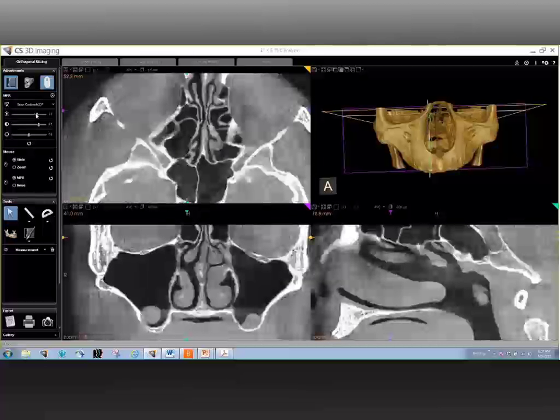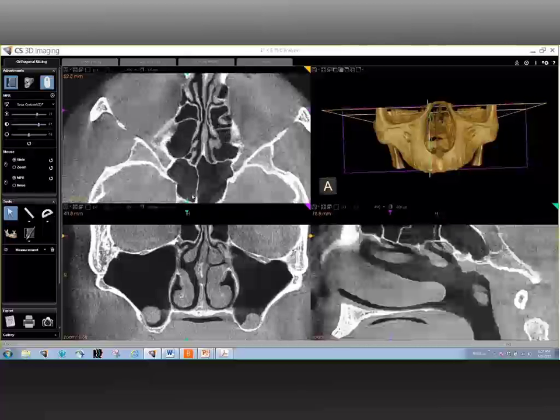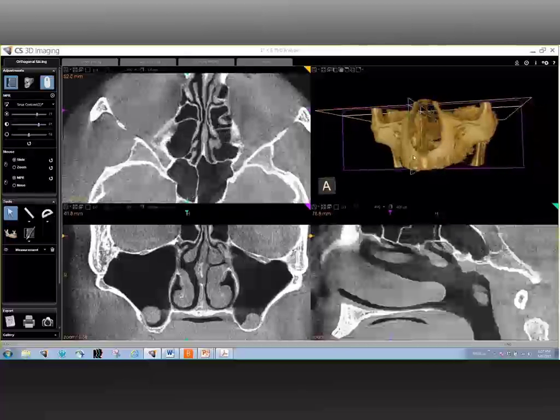So as long as we're on the subject of limitations of cone beam CT, I understand that caries cannot be diagnosed either. Would you care to comment? That is a good point. Doing a CBCT scan to visualize caries would certainly be overkill, and it is not advocated.